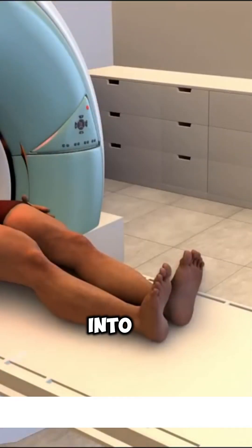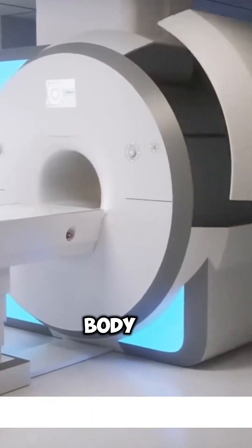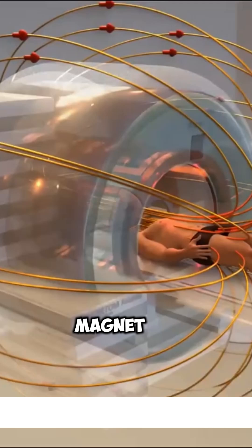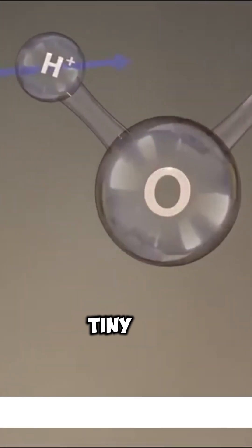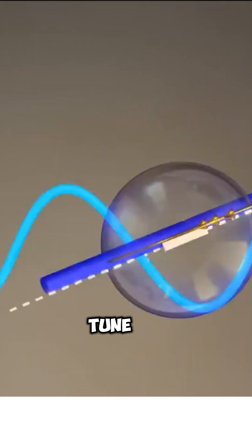Imagine this. You're stepping into a super-powered camera that can see deep inside your body. This is MRI at work. When you enter, a magnet way stronger than any fridge magnet lines up the tiny hydrogen atoms in your body, especially in all that water. Then, a burst of radio waves flips these atoms, making them sing in a special tune.